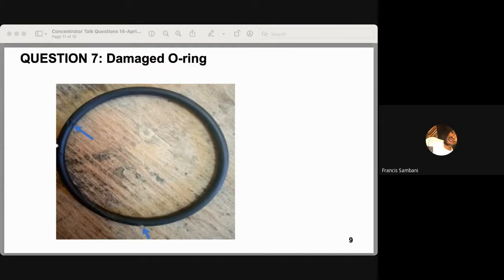So different oxygen concentrators have different pressures at which they operate. So make sure you use the required standard pressure when you're testing the pressure on the sieve bed. And if the sieve beds are able to withstand this set pressure with no leakages, the oxygen concentrator is ready to be put on an extensive test and deployed if it passes the test. So normally you deploy it maybe above 87% just to make sure that it runs for a longer time. So thank you.